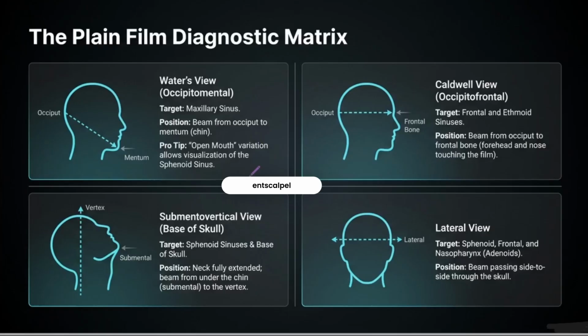So by digitally slicing the 3D skull into these ultra-thin cross-sections, the CT scan reveals the four major players we've been discussing. Right, the frontal sinuses in the forehead, the maxillary sinuses in the cheeks, the ethmoid sinuses, which sit right between the eyes, and the sphenoid sinus, which is parked deep in the dead center of the skull. Right, and the ethmoids seem particularly challenging to navigate based on the lecture. Yeah, because unlike maxillary sinuses, which are essentially large, empty cavern rooms, the ethmoids are described more as a honeycomb.